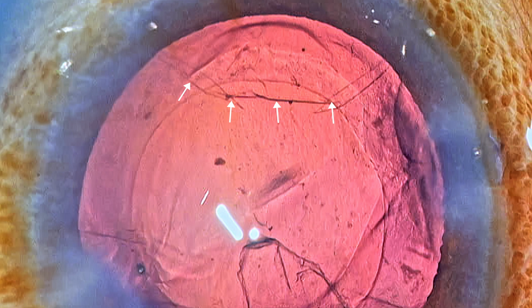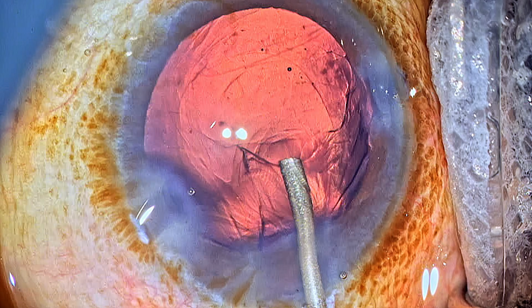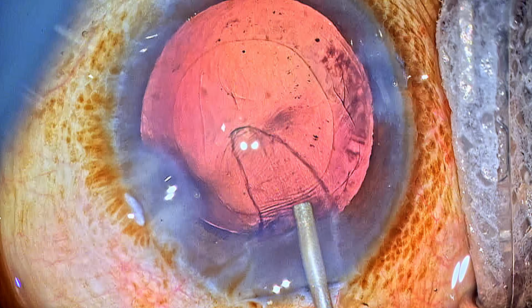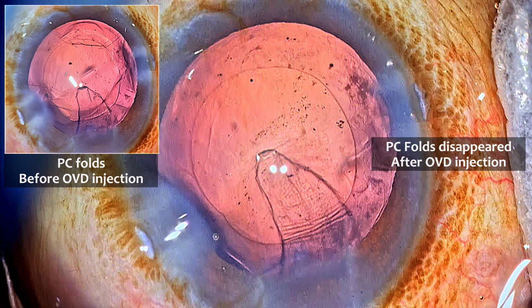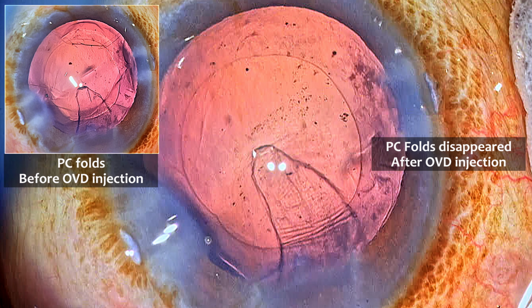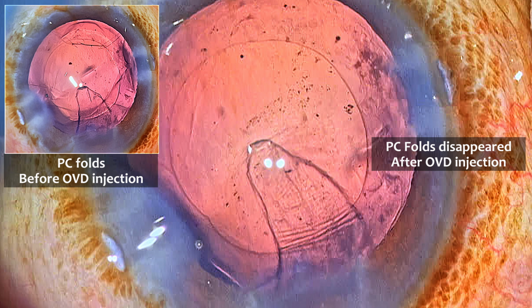This demarcation line can sometimes mimic a posterior capsule tear. A novice surgeon can get confused because of this, and one way to distinguish it from a tear is to put viscoelastic into the bag, and immediately these folds disappear. The wrinkles get ironed out, and this is a sign that it was a pseudo tear-like appearance, primarily because of the wrinkling of the posterior capsule, which was secondary to the weakness of the posterior zonules.